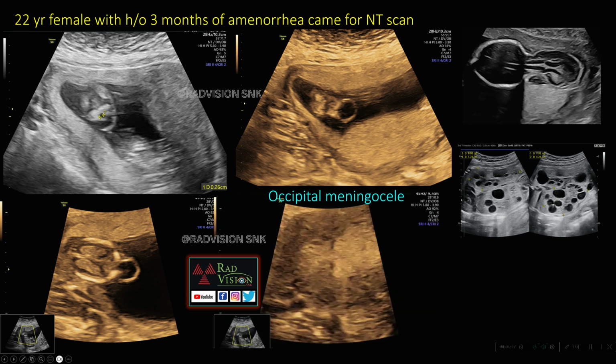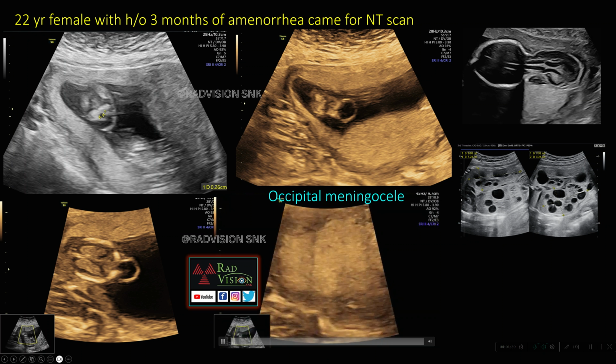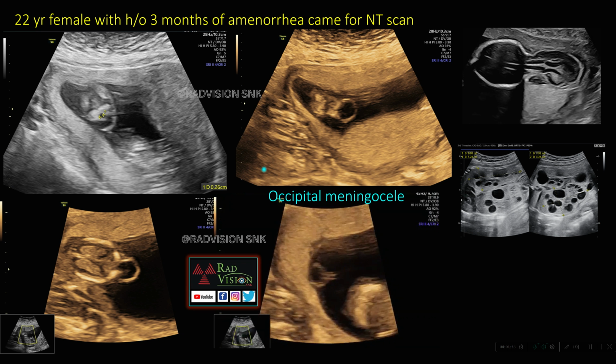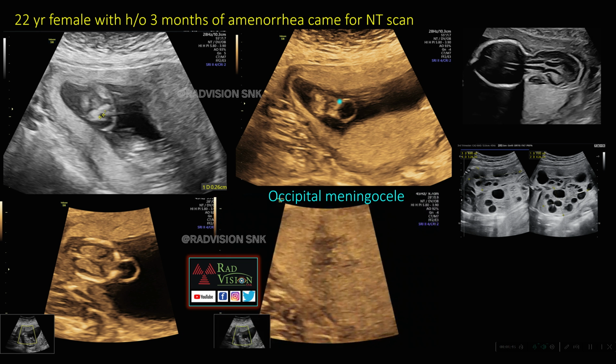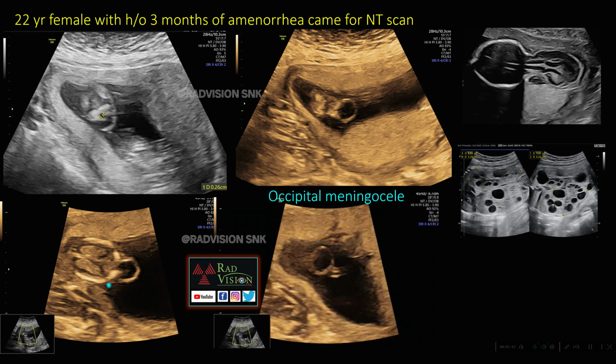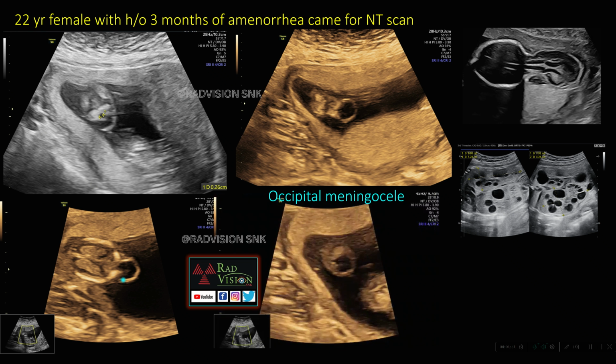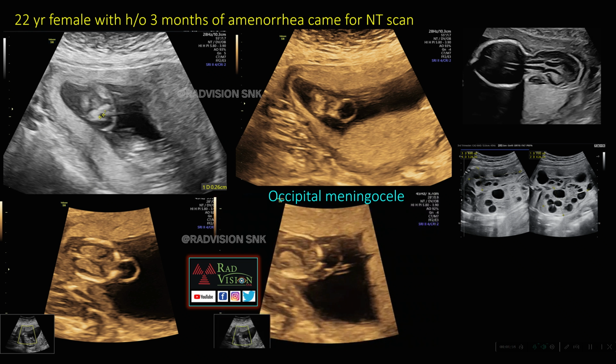Here this is a 22-year female. Here we will play the video. 22-year female with history of 3 months of amenorrhea, came for NT scan. Here you can see there is a small outpouching noted arising from the defect noted in the occipital bone, and the meninges are seen protruding through the defect. So this is a classical case of occipital meningocele.